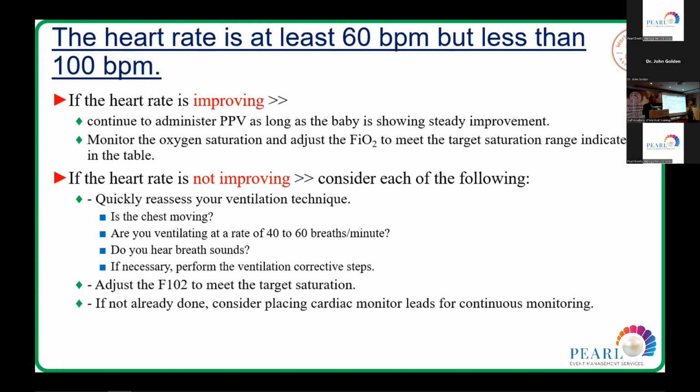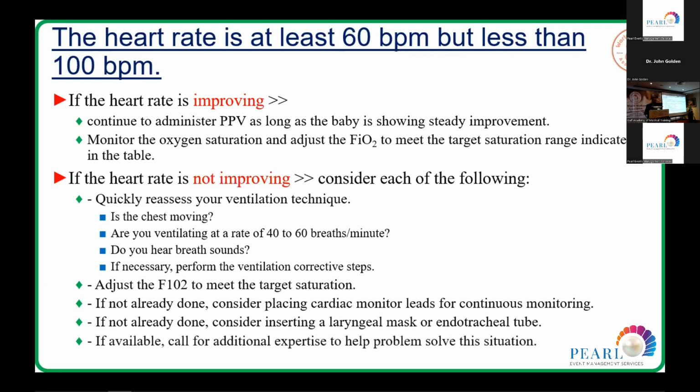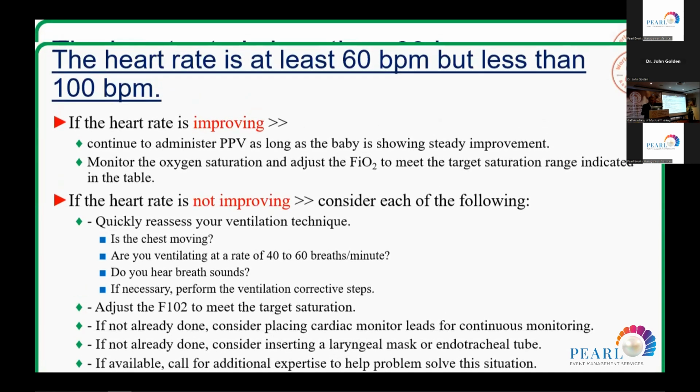If not already done, place a cardiac monitor and leads for continuous monitoring. If not already done, consider inserting a laryngeal mask or endotracheal tube. If available, call for additional expertise to help solve the problem.